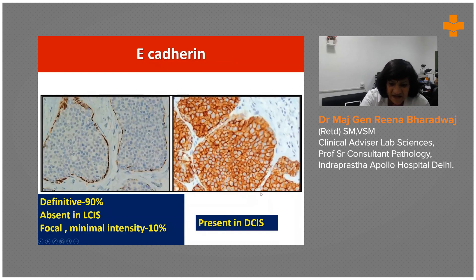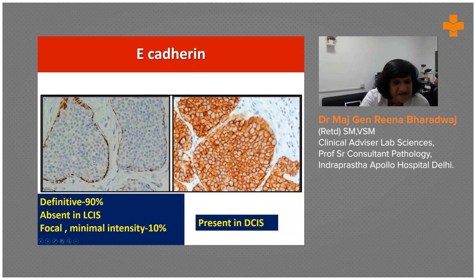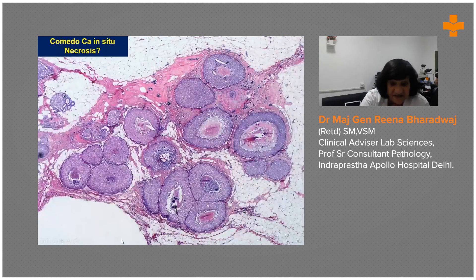If you still can't make up your mind, you might want to use e-cadherin. E-cadherin is always present in ductal lesions, very nicely brought out, and it is absent in lobular lesions. This is a low-grade DCIS on the right and an LCIS on the left — absent, and even if there is occasional focal positivity, it will be of very minimal intensity.